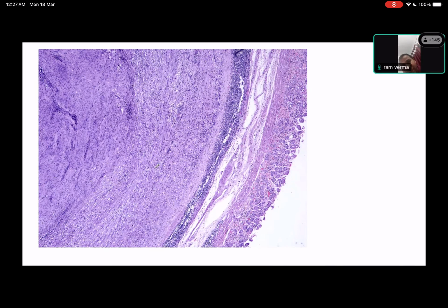I'm saying there is a good clue here because of which I'm thinking of a specific type of tumor. Somebody was wanting to say. Schwannoma. Who said that? Chaitanya? Yes, ma'am. Okay, why? Because they are circumscribed. Lymphocytic cuffing, I could see.